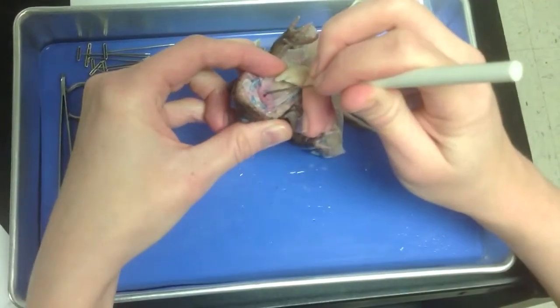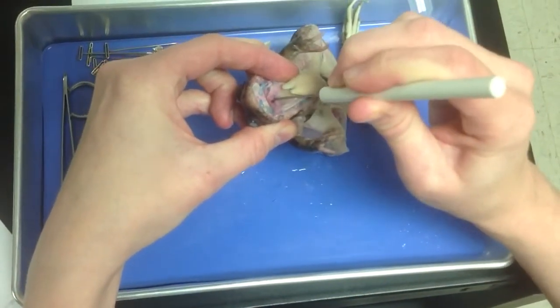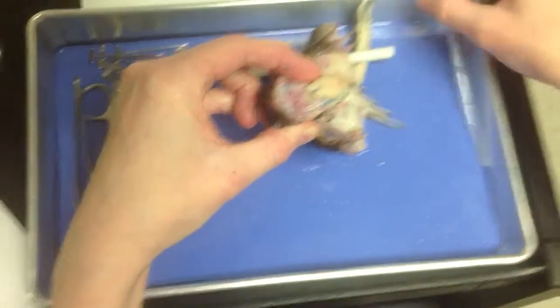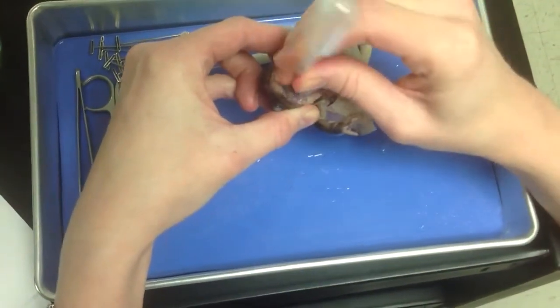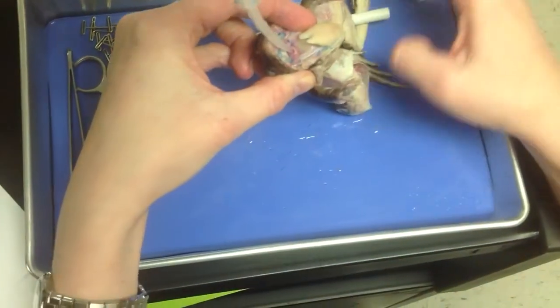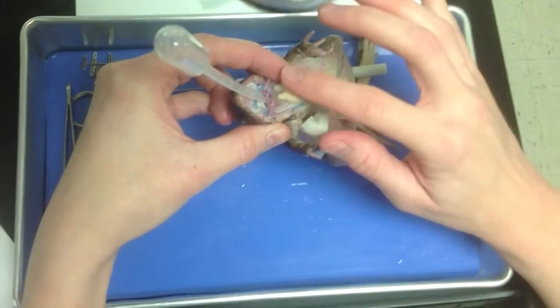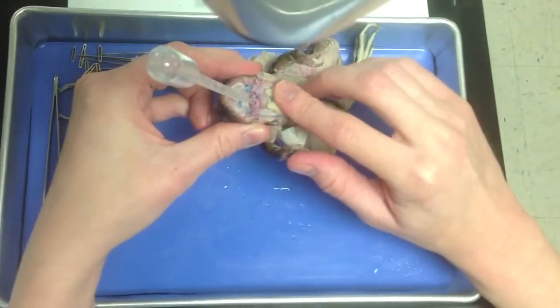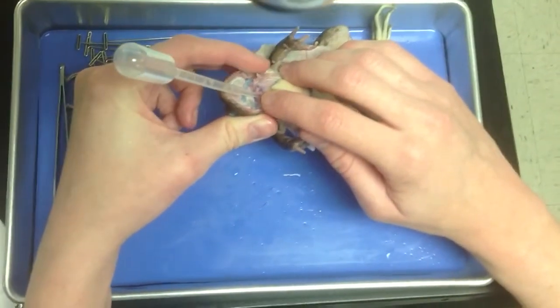So once you've got this — does everybody see how this is probed open now? Once you've got it probed open, that's when you're going to insert your pipette into that hole. Go ahead and find the entrance of the trachea, use your probe to open it, and place your pipette.